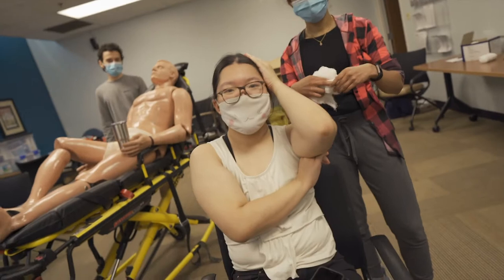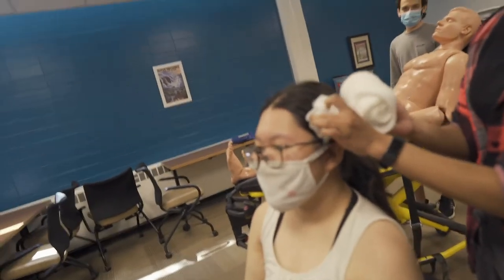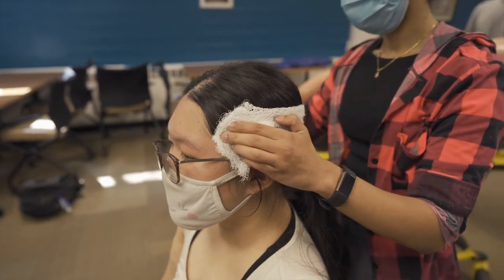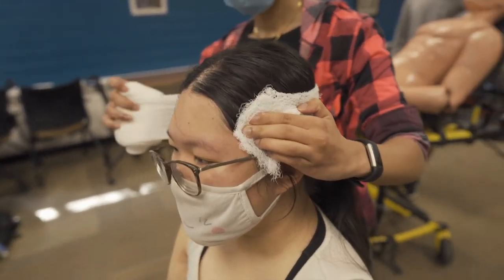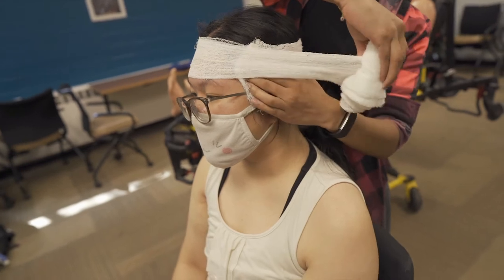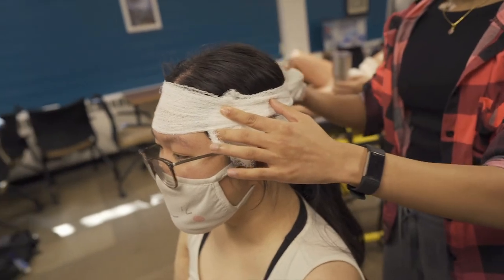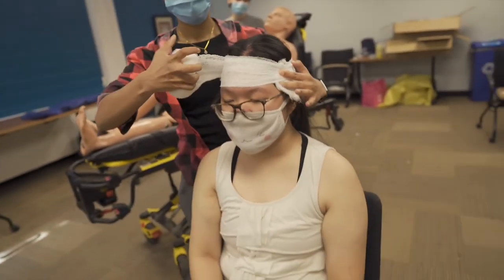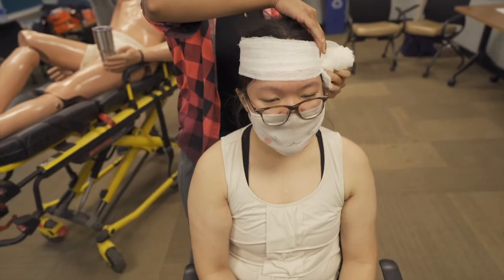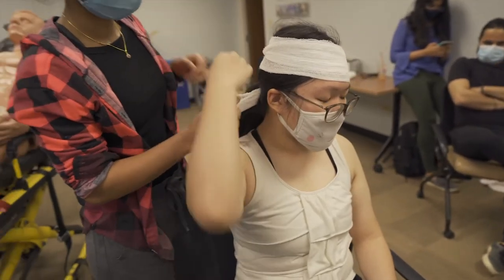Go ahead and apply — Anna, we're going to control that bleed. Diane's going to apply a gauze and then start rolling the gauze off the roll, which is more natural to do. The first go around, we really just want to secure the piece of gauze to Anna's head. Diane is pulling the roll tight — we want to apply and maintain that pressure onto that site. You can roll it a couple times to create an even tighter pressure. Then Diane's going to go under Anna's head, the back of the head, and come back around. The goal is to make a figure eight with the roll.